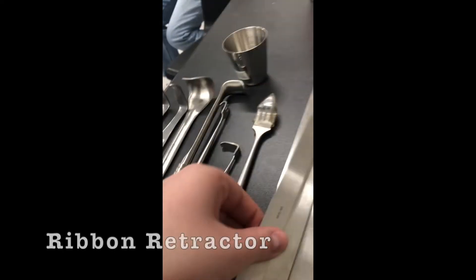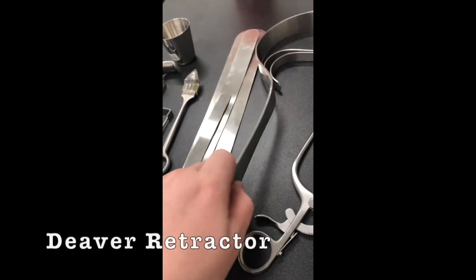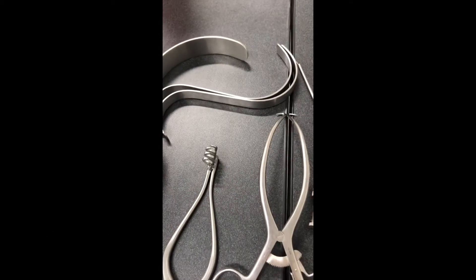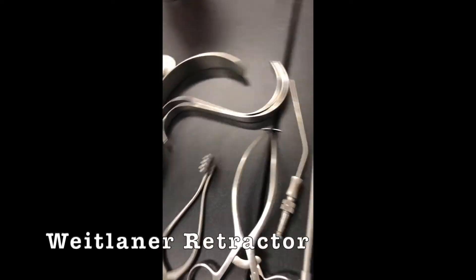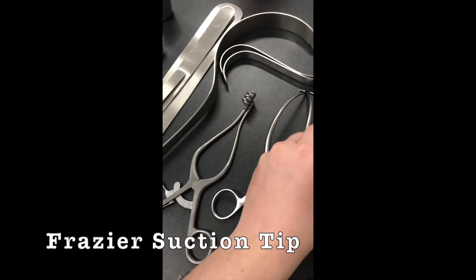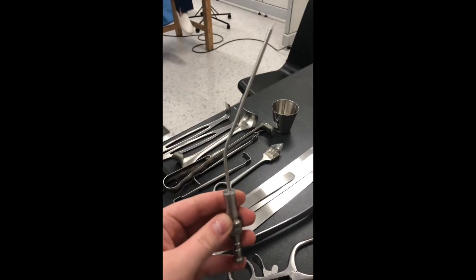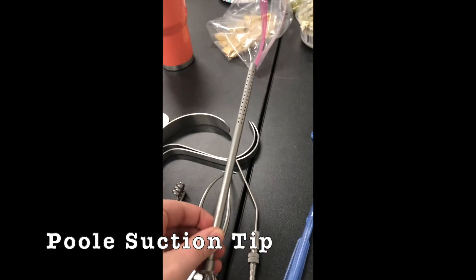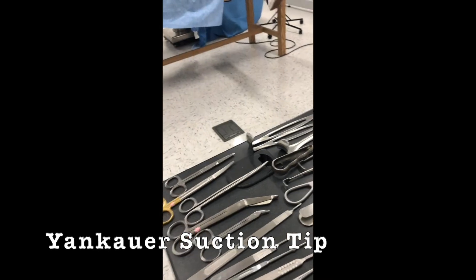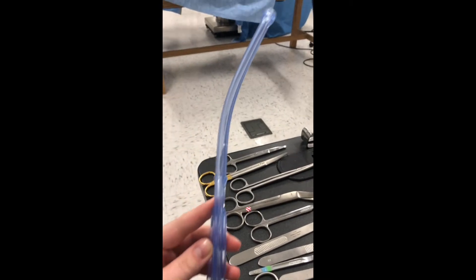And then the shot glass or medicine cup — these are the malleable ribbons. We've got the Deaver, the big beaver, and then the S-retractors, and then the Weitlaner. We all know the Gelpi. Now I have no idea — the Yankauer.